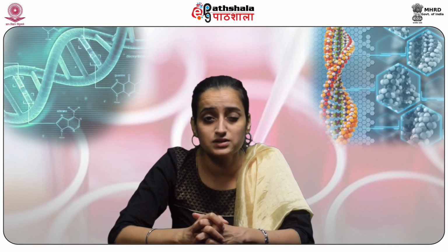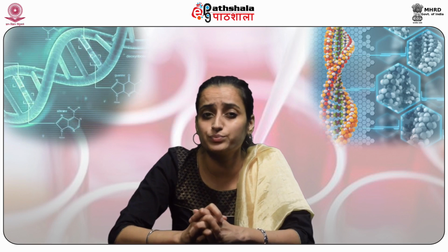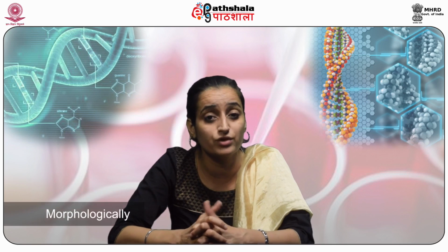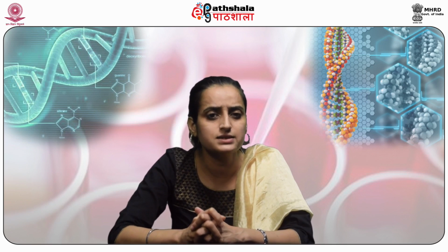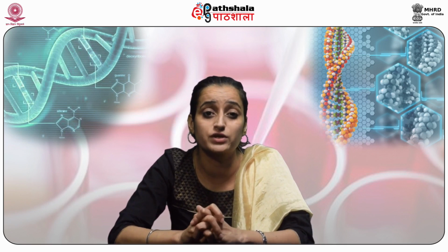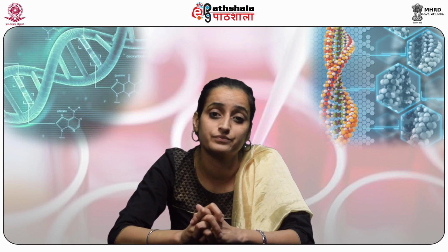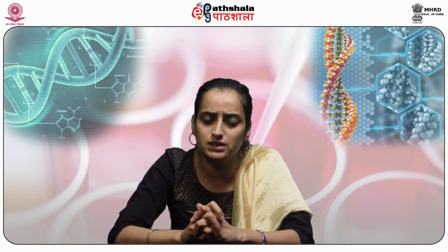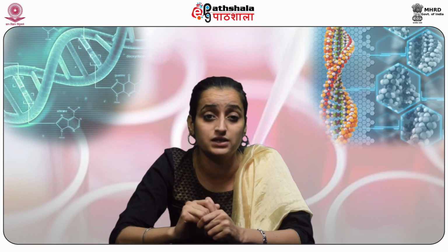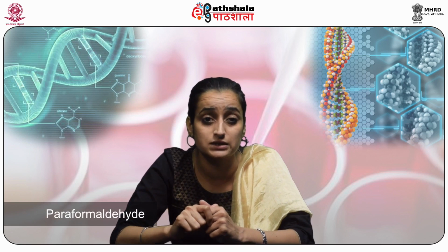Limitations. In situ hybridization requires good preservation of cells and tissue sections to be studied, such that they can be identified morphologically. The cells and cellular structures should be distinct and intact. Together with preservation, strong hybridization signal is crucial. However, fixation decreases the accessibility of the probe to the target. This happens due to the use of fixatives like formalin, paraformaldehyde.